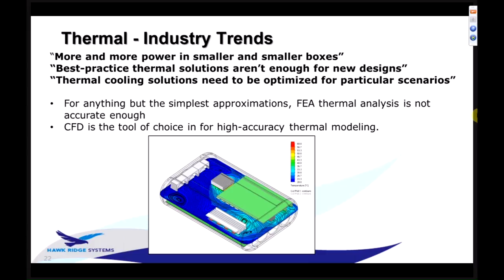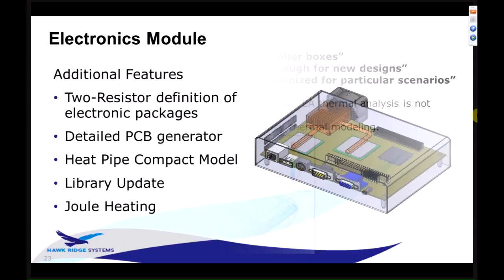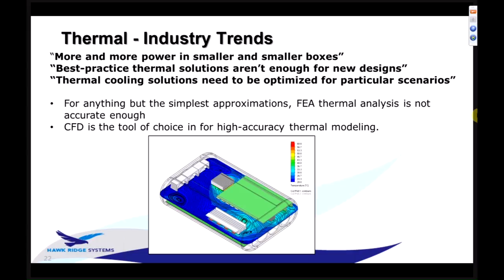So a CFD tool like SOLIDWORKS Flow Simulation, heating and cooling is the most common application of that tool. It allows us to basically model fans, heat sources, electronic components, hit go, and see what the flow patterns develop like, and see what temperatures we're achieving inside that box. From there, because we're tied to the SOLIDWORKS CAD solution, we can then go about optimizing the individual conditions: fan positions, heat sink positions, heat source locations, flow directing devices like baffles or deflectors. Go optimize all that stuff to get an ideal thermal solution to a particular problem.